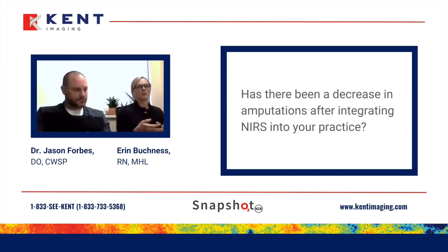So it's not just the initial, it's the ongoing, the trend of those patients, especially when they are some of your more complex populations that you say, okay, well, what am I missing? Okay, let's re-image them and see where they're at. We could take that one piece off the table and focus, and then really get focused on what we need to do. Well, we have found that in a couple of patients where they need to go on to have either FemPop or additional interventions in order to gain adequate flow.